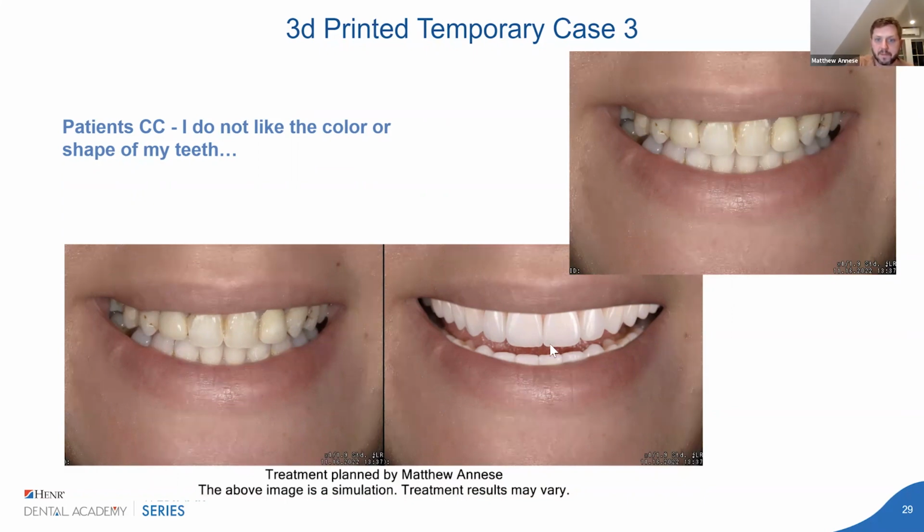looking at the smile. And basically with this patient, we just did a quick DTS Pro or a Smile Design or something. This takes me like 2 minutes to do, or I show them before and then afterwards. There's a bunch of different softwares. This is what I usually use to promote cases or show patients or educate patients on what's possible before and afterwards, less so than the mock temps. But this really helped show the case and tell the patient that, hey, we're going to live with temporaries, and it really helped in this case.